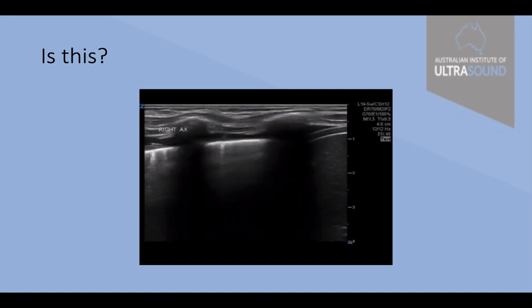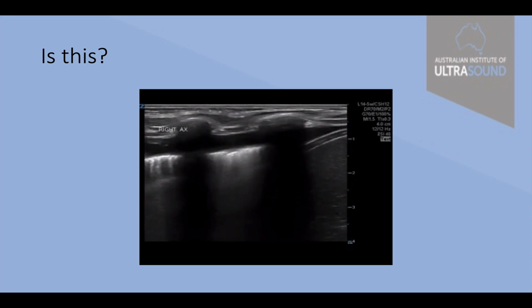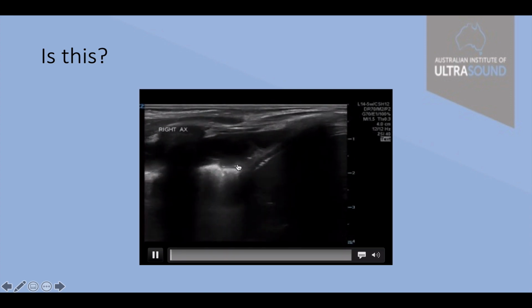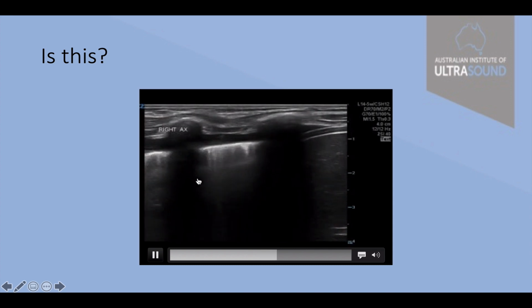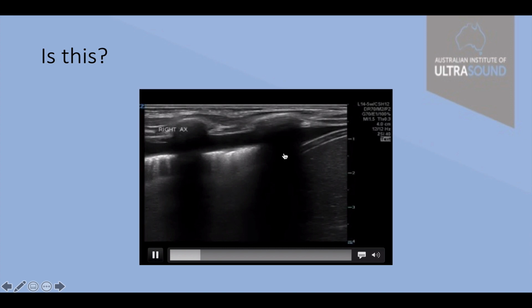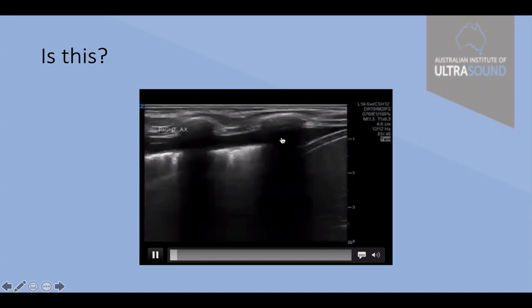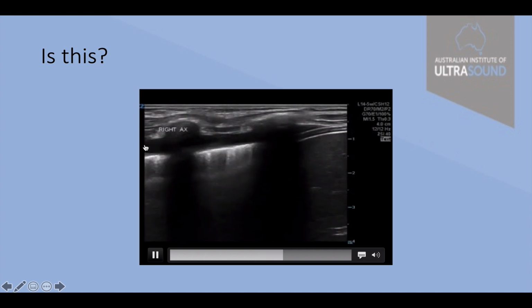Now this is using a straight probe, so we're seeing a lot more clearly. We're looking again at the base of someone's lung. The strip on the side here is in fact diaphragm. Beautiful view. A little bit of what looks like tethered lung. It's abnormal. It shouldn't have this amount of icicles hanging off it. It shouldn't be stuck to the diaphragm as it is. But here we have a strip of what appears to be very likely free fluid, pointy edges dark and allowing free movement. A small pleural effusion, essentially.